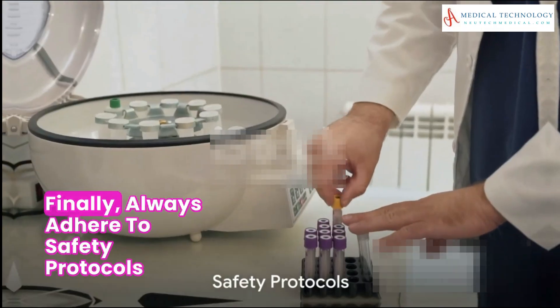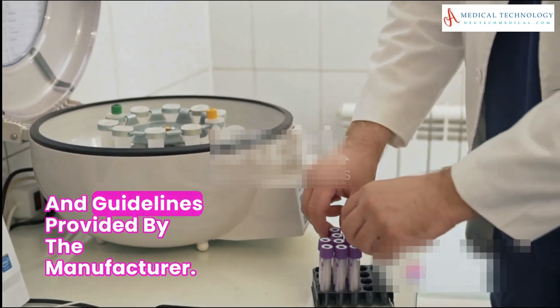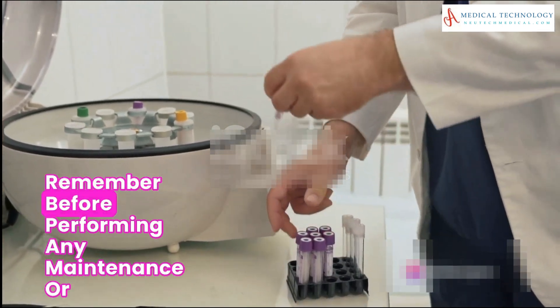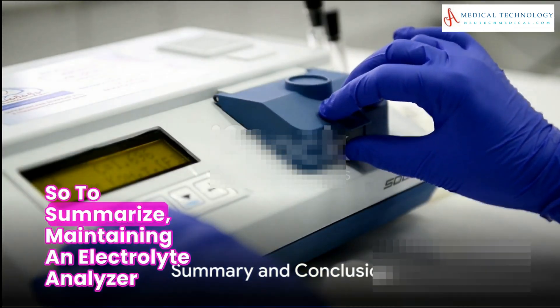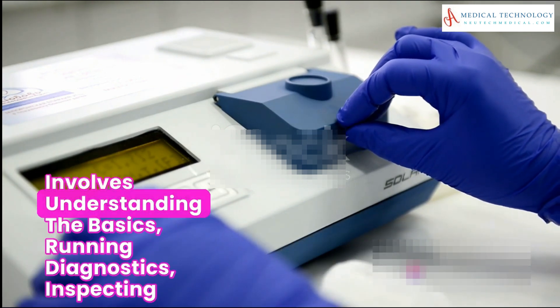Establish a routine preventive maintenance schedule as recommended by the manufacturer. Always adhere to safety protocols and guidelines provided by the manufacturer, and remember — before performing any maintenance or repair procedures, disconnect power sources.